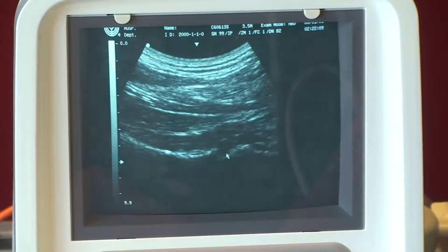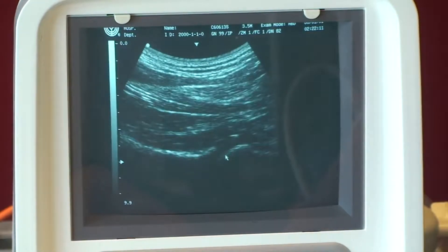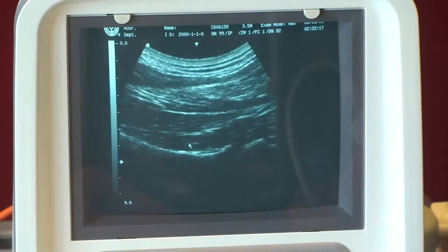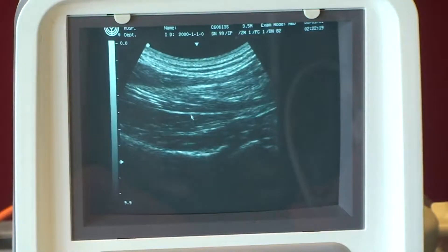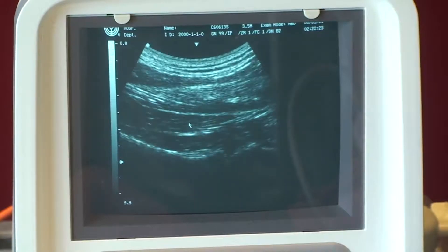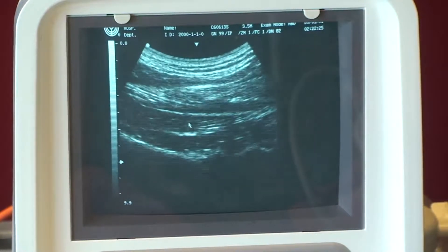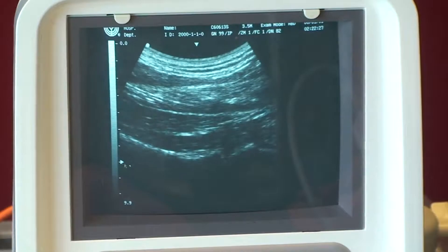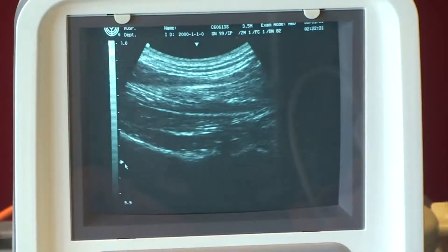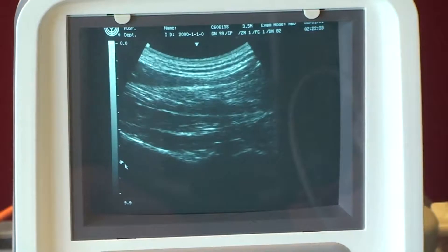Just to the right of the screen, I can see the femoral head — there's the joint space — and here's the glute minimus, and the medius is above it. I'll bring my focus position, just on the left of the screen using this arrow, and adjust it to see if it helps me get a better image. I think it's good where it is.